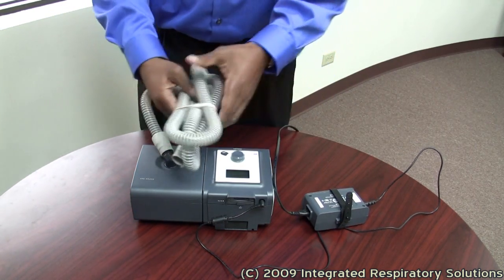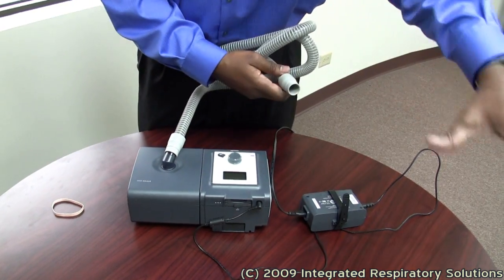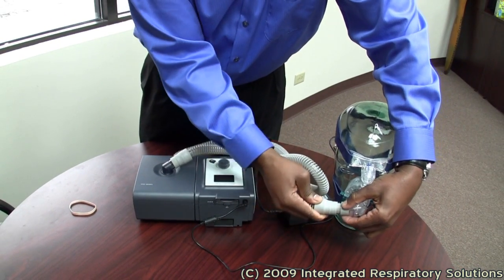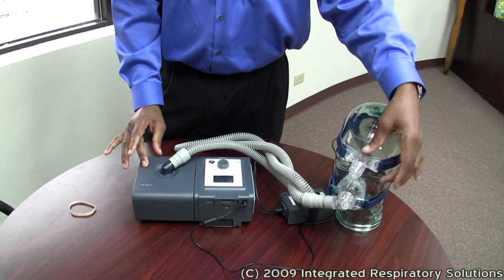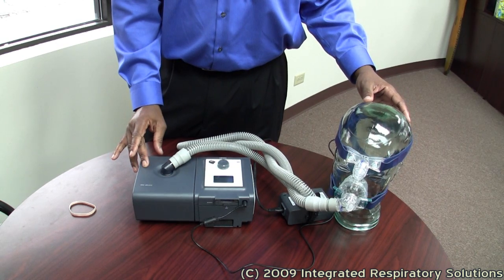Your CPAP or BiPAP tubing is connected to your mask. Your tubing is your bridge between your CPAP device, the mask, and the patient. This concludes our video on assembling a CPAP BiPAP device.